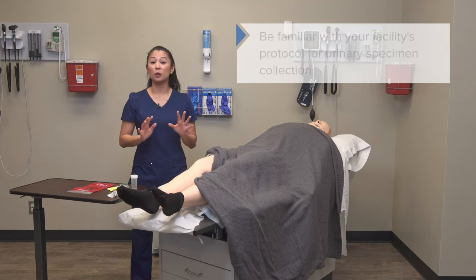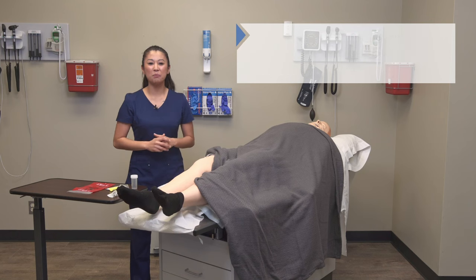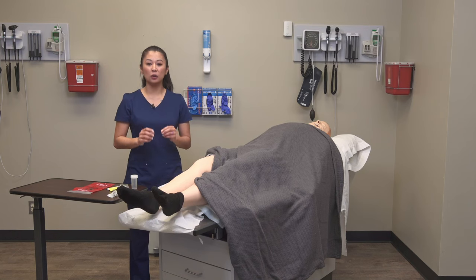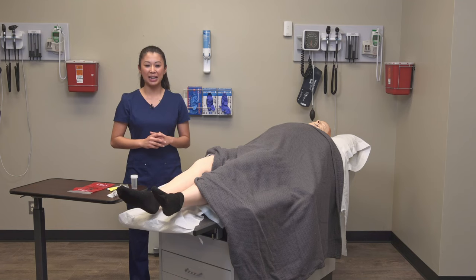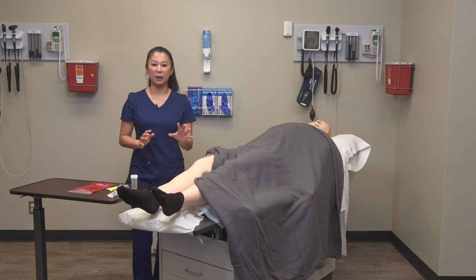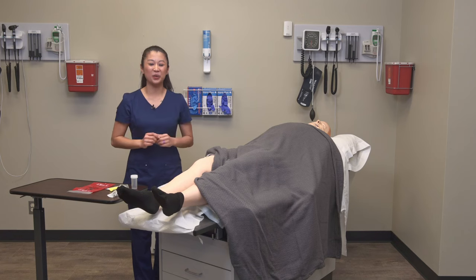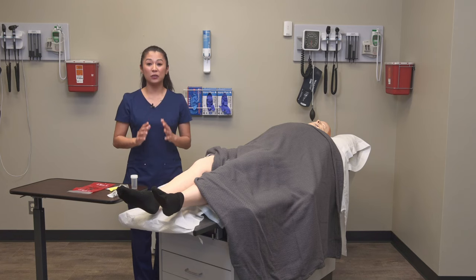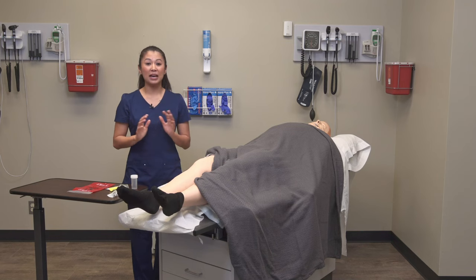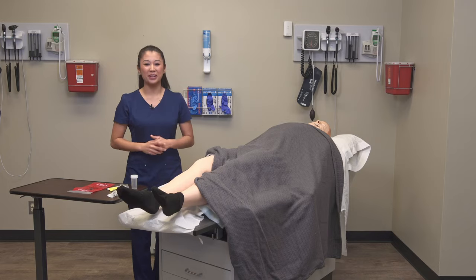Let's take a look at what we're going to need. We're going to need an alcohol swab to clean that port, a syringe so we can pull back the urine, and also the designated specimen container that your facility uses. It's a great idea to grab a laboratory biohazard bag — you want to make sure you put and secure this specimen in here. And of course, it's really important to label your specimen. That's a big deal — it's really important to get the right results with the right patient.